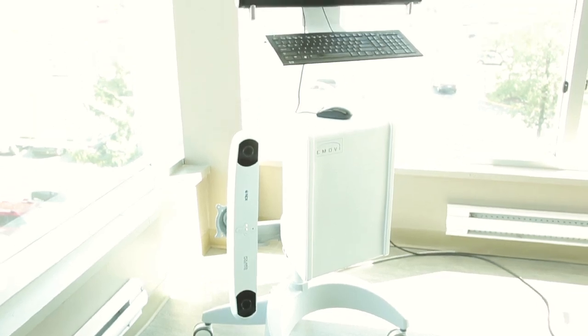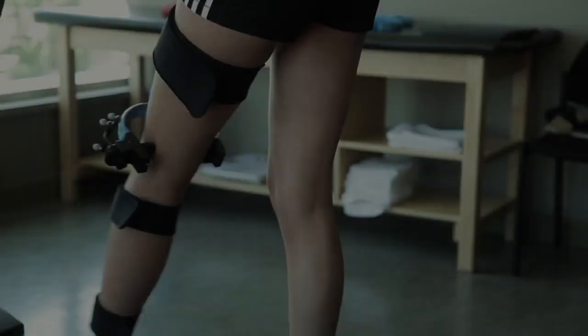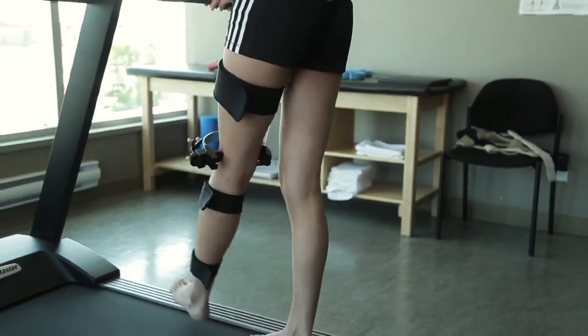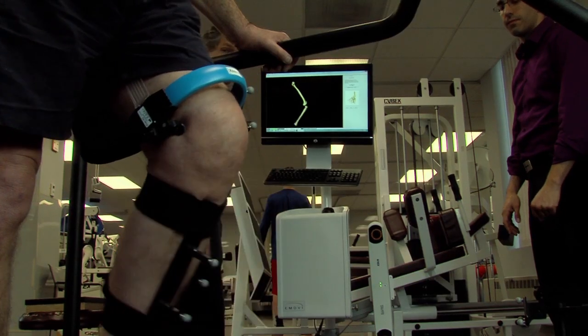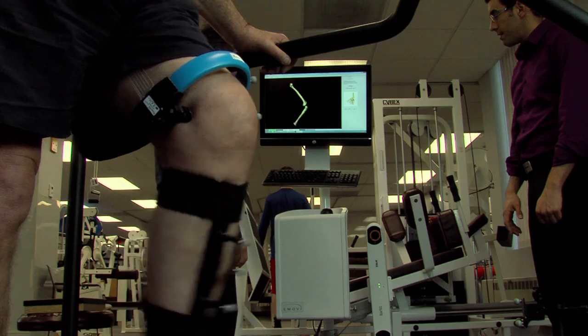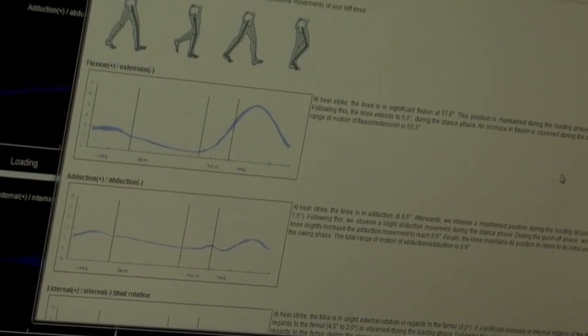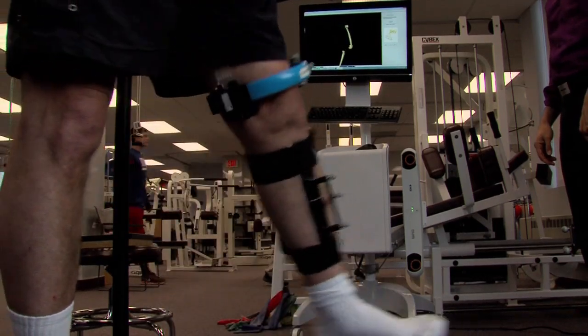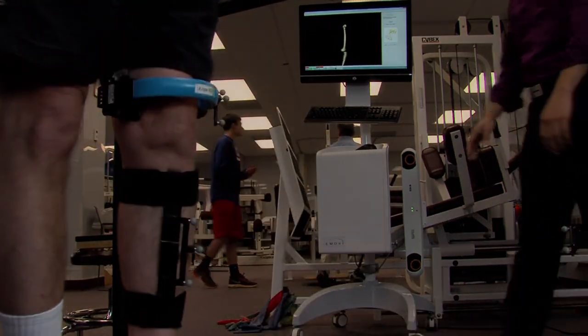So we have a camera that's mounted on a cart that follows the movement of the trackers that are placed on the femur and the tibia. And then the software then after is able to actually identify deficiencies in the function of the knee joint. The KneeKG is the first ever system for objective measurement and documentation of the 3-dimensional function of the knee joint that can be made available to patients in an outpatient clinic or rehabilitation center.